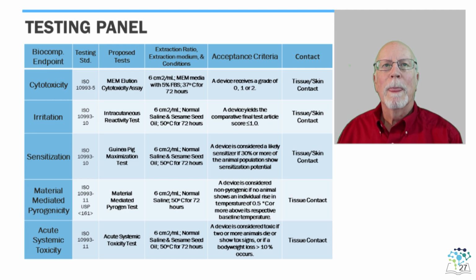A1. This table shows the big 5 biocompatibility assays most commonly run and required for nearly all minimally invasive devices, along with the accepted extraction methods, assay conditions, and target results, which, if attained, will qualify the device as safe with respect to these specific endpoints and these particular standards.